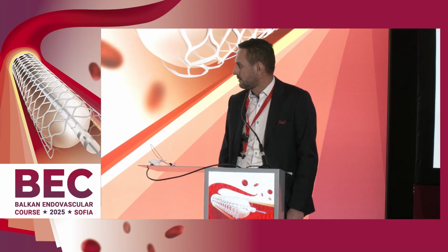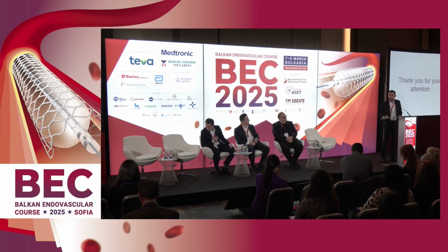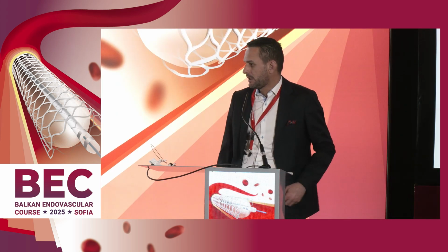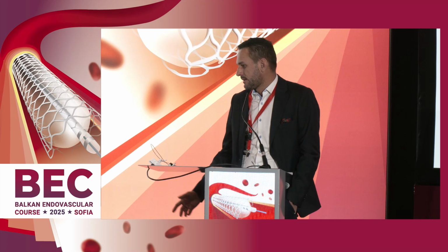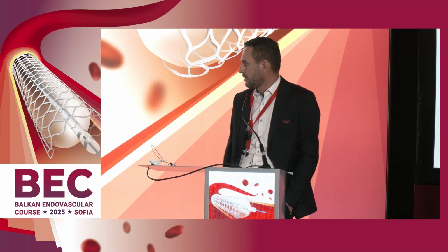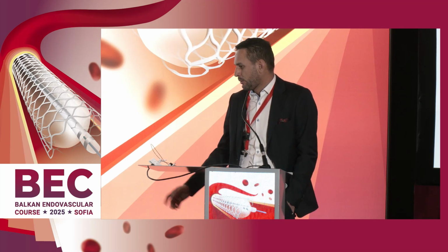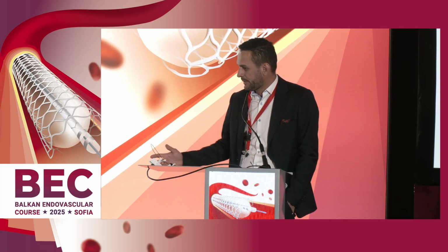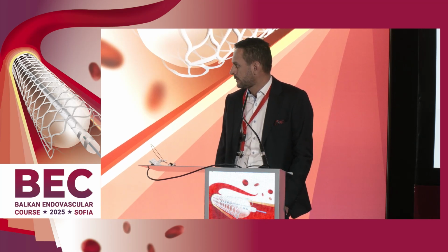How do you select patients for primary tibial access? The patients with previous intervention, where we have data from the angio. We know we can proceed with radial access only for the angio, to decide on the tibial approach, and after that, when we have the data for the patient and for the lesion, we take the tibial approach as the primary approach.